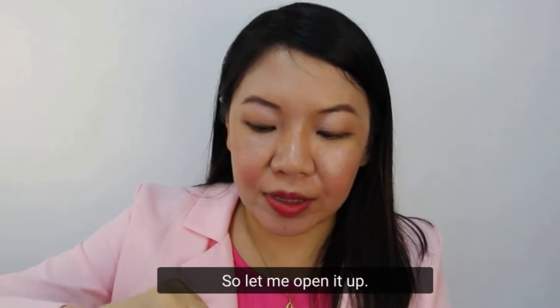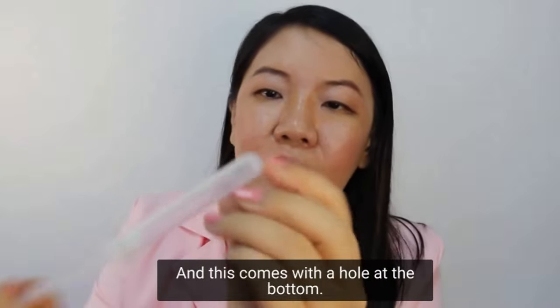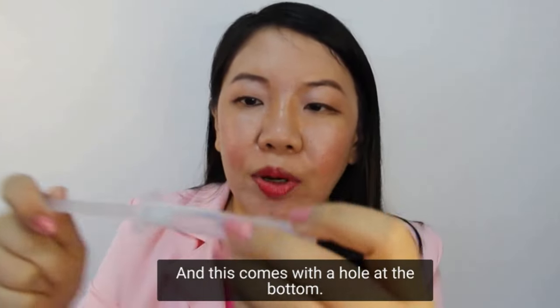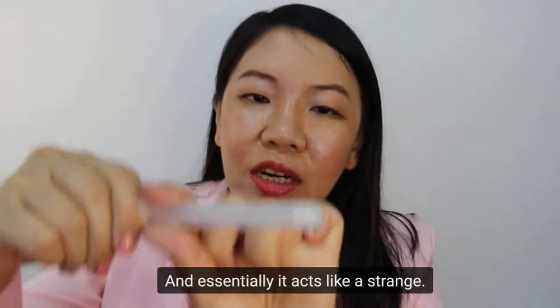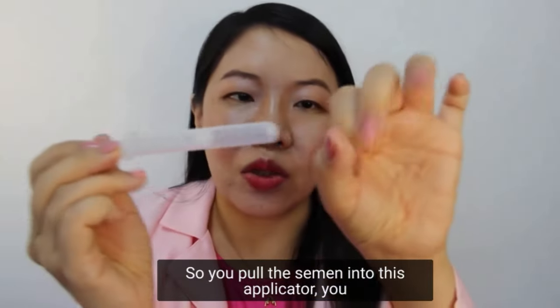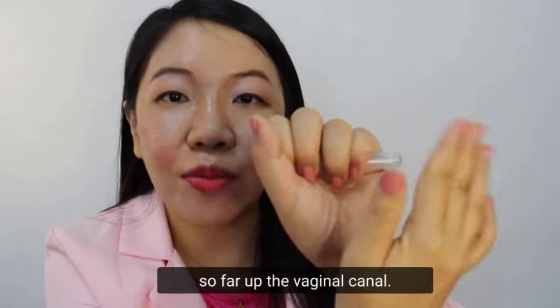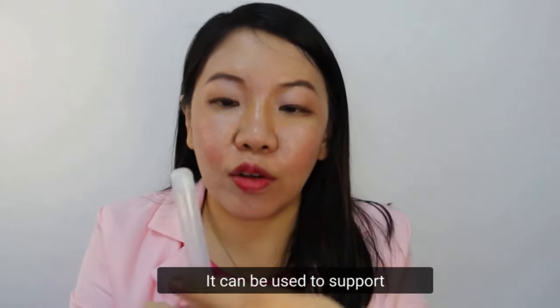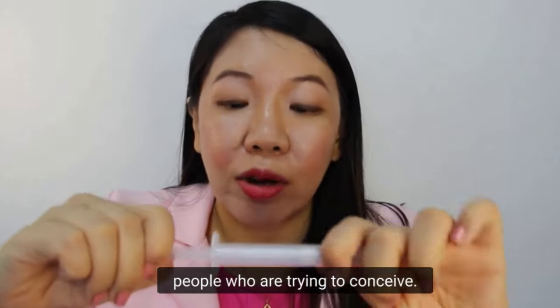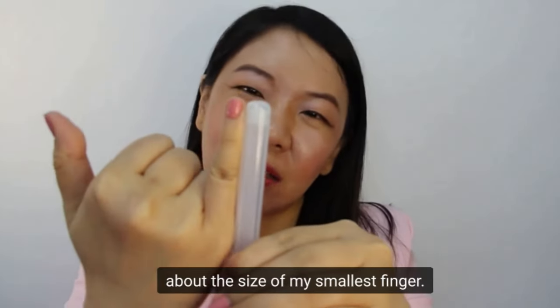Let me open it up so you have a look. It's meant for single use and this comes with a hole at the bottom — essentially it acts like a syringe. You put the semen into this applicator, insert this into the vagina, and then release it so that the sperm doesn't have to swim so far up the vaginal canal. It can be used to support people who are trying to conceive, and the size of this is really about the size of my smallest finger.